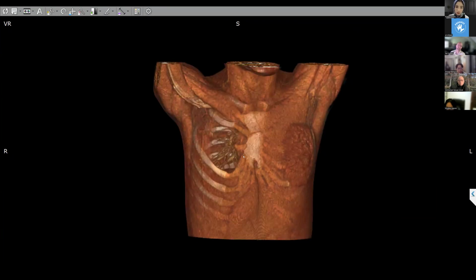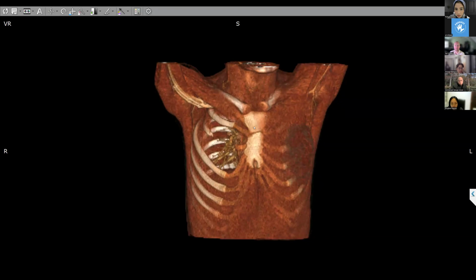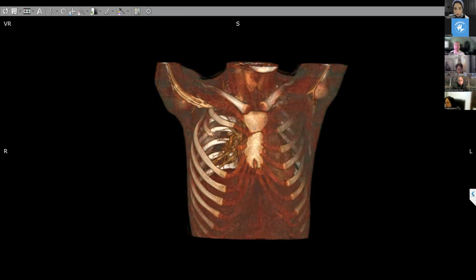No, it's a very excellent thought. I think that's spot on. You're probably very right about that. Because there's the cartilage too. You can see the cartilage medially, right? But it's not as long as the other side. If you window it a little bit differently, you can decrease some of the other soft tissues and accentuate the cartilage and the bone. And you see that also a piece of the cartilage is missing. So I think Dr. Yogi is correct about that. Very interesting.